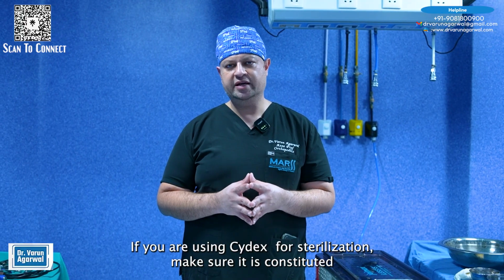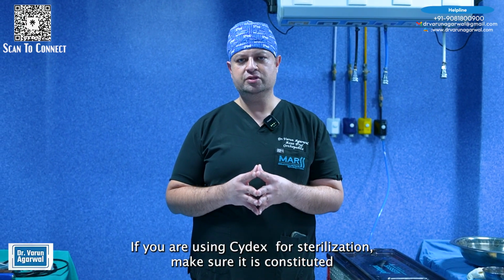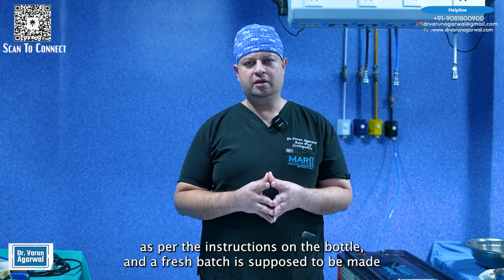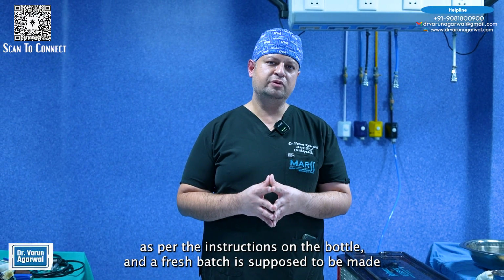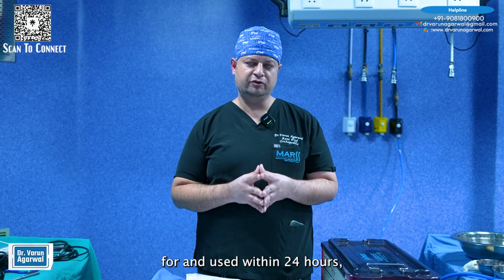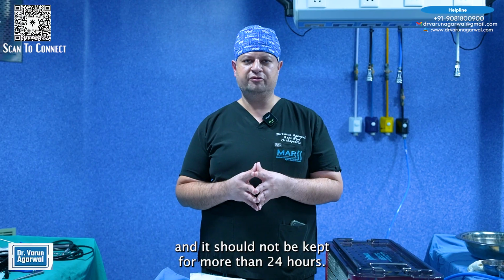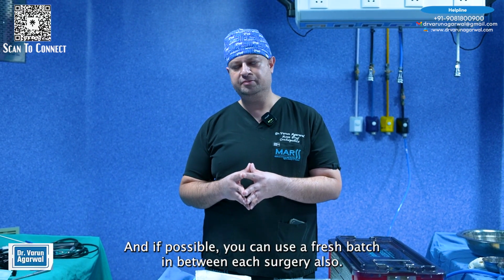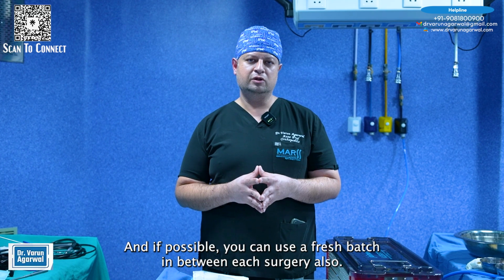If you are using Cydex for sterilization, make sure it is constituted as per the instructions on the bottle, and a fresh batch is supposed to be made and used within 24 hours, and it should not be kept for more than 24 hours, and if possible you can use a fresh batch between each surgery also.